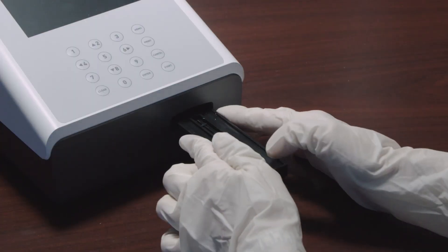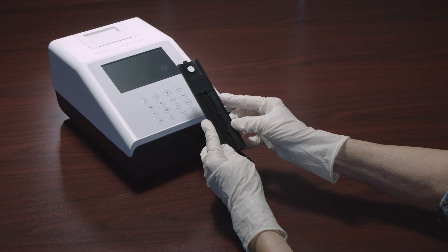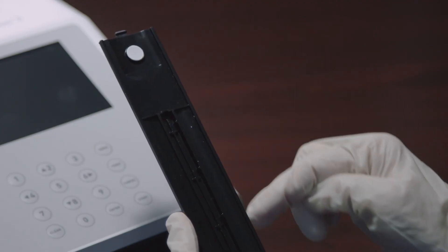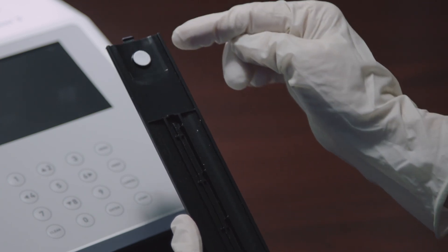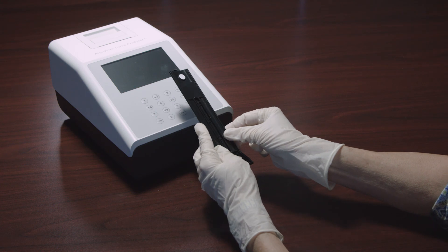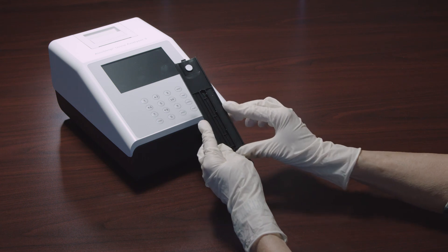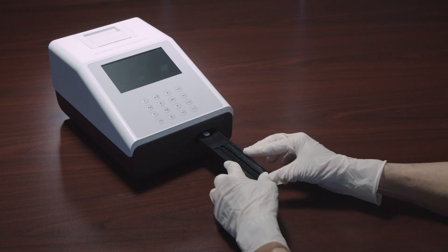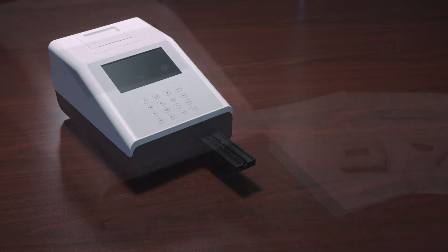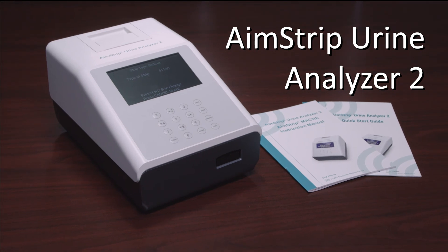Remove the strip holder from its mount by pulling out the sides. Gently clean the strip holder using a lint-free, non-absorbent cotton swab ball with distilled water — be careful to avoid touching the white calibration circle. Dry with a clean, dry cotton ball. Examine the white calibration circle to ensure there are no nicks or dirt present. Place the strip holder back on the mount with the white calibration circle facing up and positioned towards the analyzer. This concludes the operational video for the AimStrip Urine Analyzer 2.